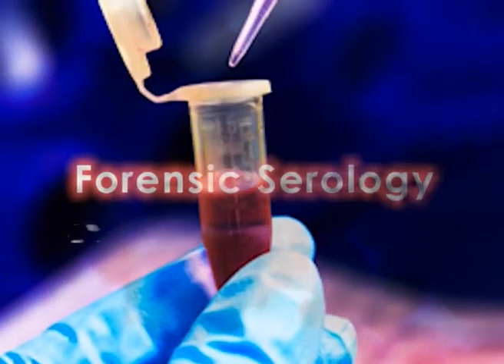The bound antiglobulin can be detected and measured by the addition of an enzyme substrate. The enzymatic catalytic reaction is similar to the antibody sandwich ELISA procedure previously described.